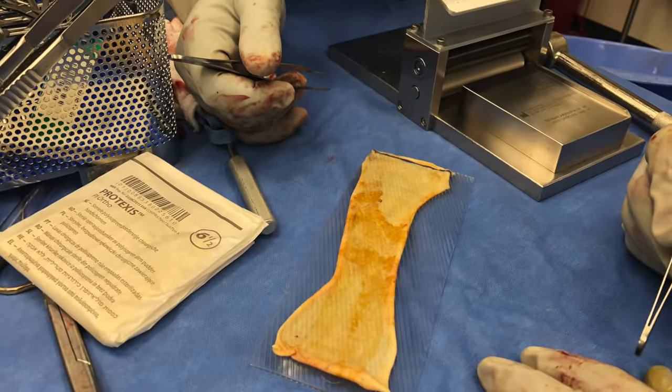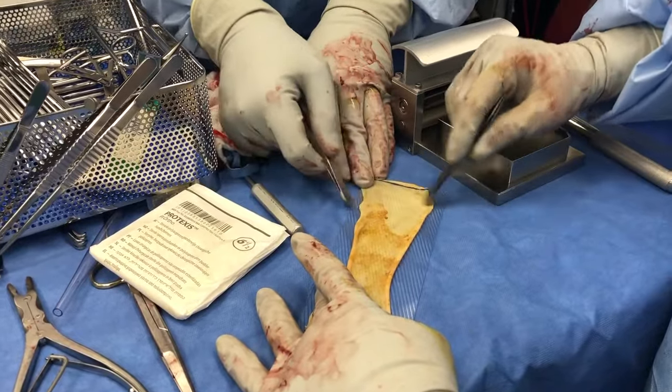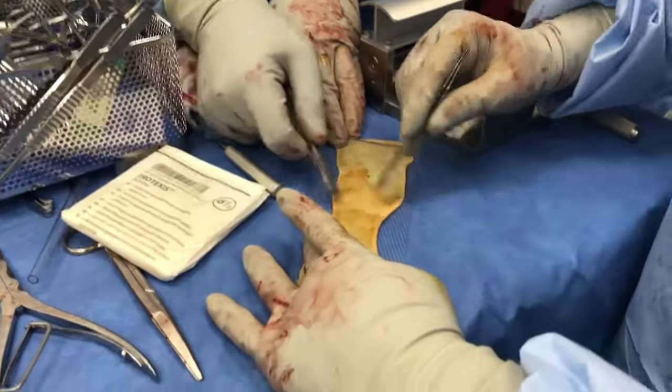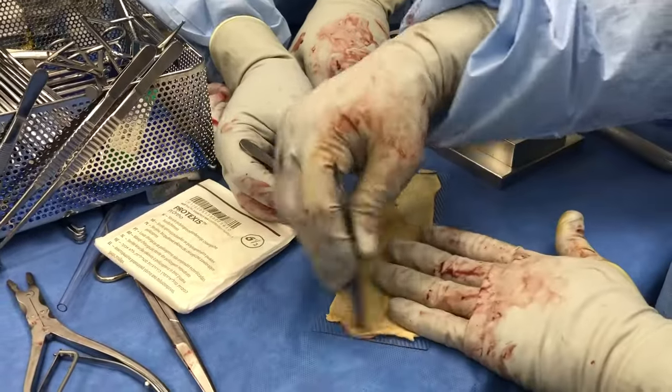The skin graft is placed with the epidermis up. You can tell this because it curves down towards the underlying surface. The serrated or rough side of the plastic carrier should be placed towards the skin graft.